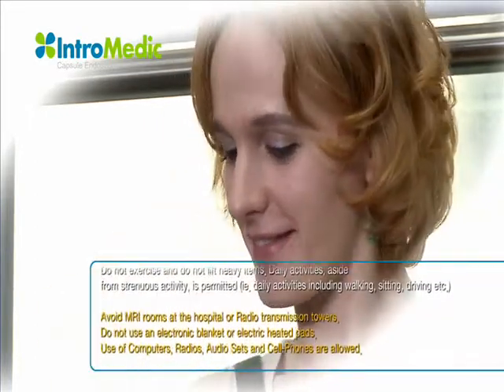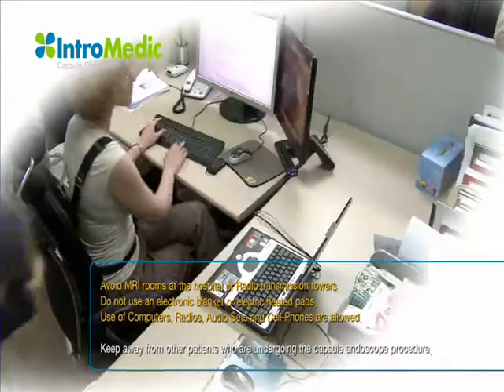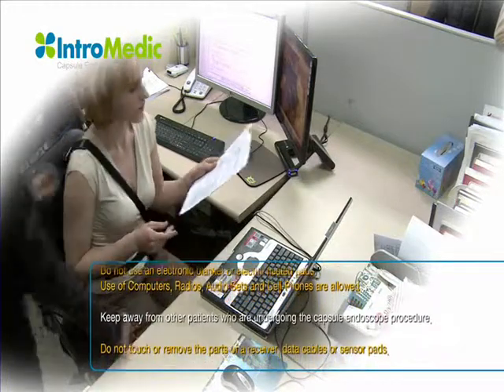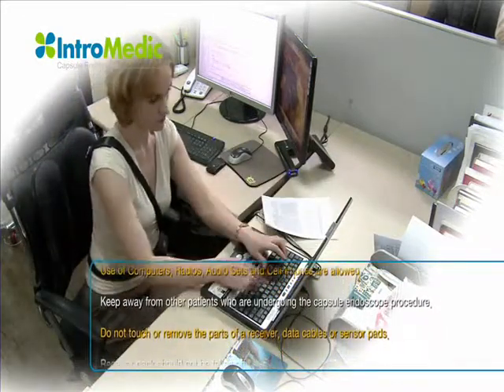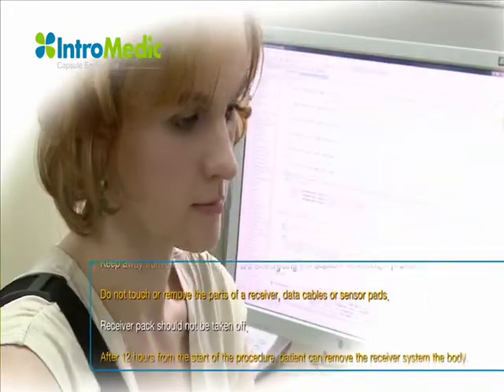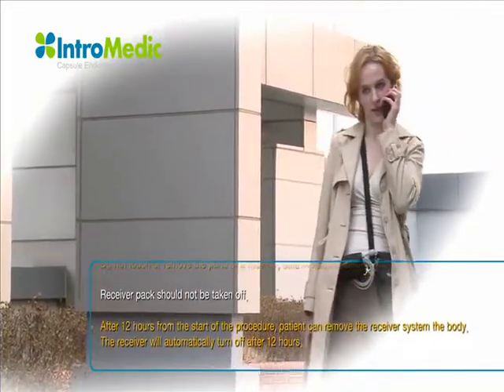The patient must avoid MRI rooms at the hospital. Do not use an electronic blanket or electric heating pads. Use of computers, radios, audio sets, and cell phones are allowed. Do not come in direct contact with other patients who are undergoing the capsule endoscope procedure. Do not touch or remove the parts of the receiver, data cables, or sensor pads.